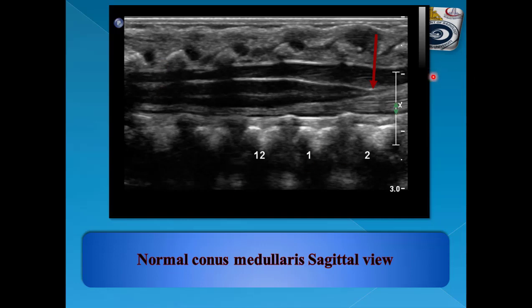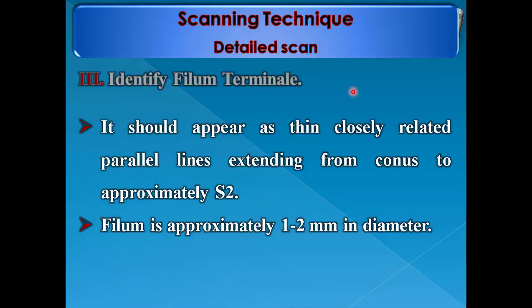Normal conus medullaris at L2 vertebra — the red arrow shows the conus medullaris at L2, which is the normal position. The third question is to identify the filum terminale. It should appear as closely related parallel lines extending from the conus to approximately S2 vertebra. The filum is approximately 1 to 2 millimeters in diameter.